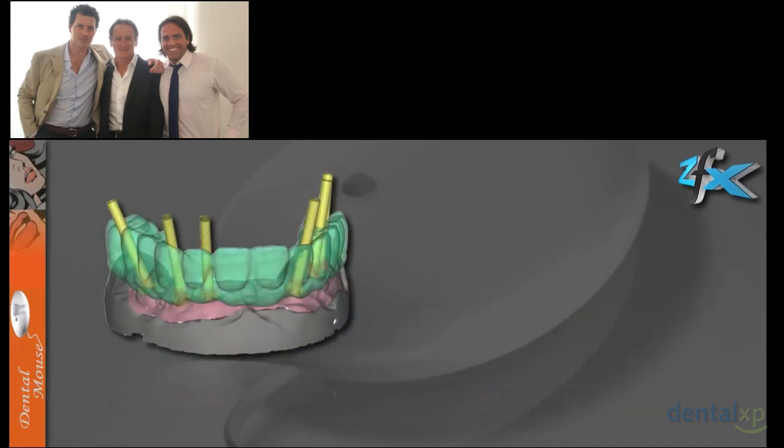You can actually see through, because you can see from this picture that it's really nice, you can lower the opacity of the prosthodontic project and see inside the actual inclination, where the canals are, and how much thickness you have for each of these canals. So these are information that before, without the new technologies, you could not have. They are important to have, especially for the technician.